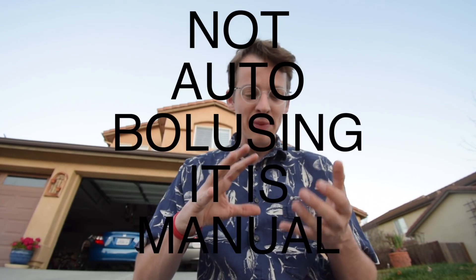For less than $250, you can be set up on automated bolusing, basal rates — actual automated blood sugar control. Now it's not a perfect system.